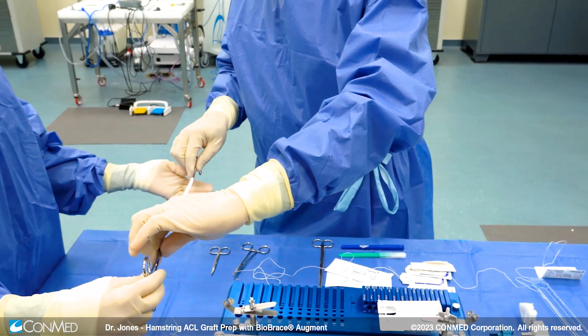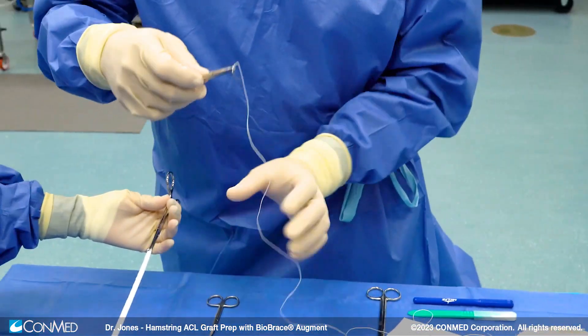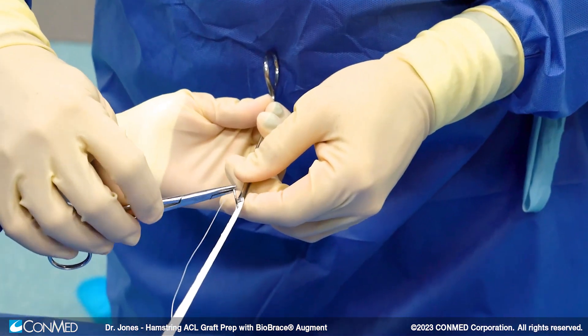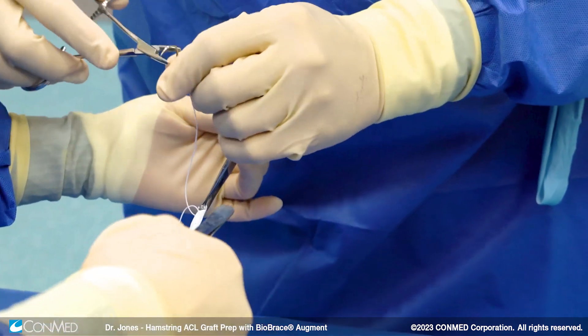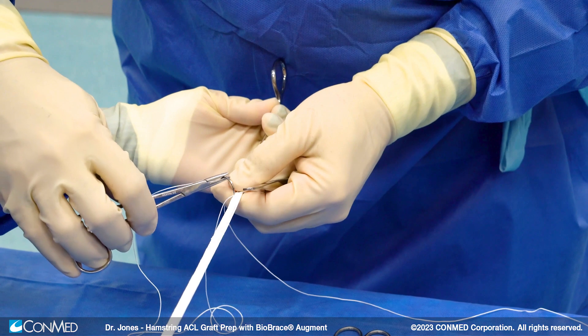I'm going to use the CommEd Infinity button on the femoral side and the CommEd tibial exo shape on the tibial distal fixation side. I'm using a number two suture to do a standard whip stitch, evening our ends out, usually about a centimeter apart as I come down.